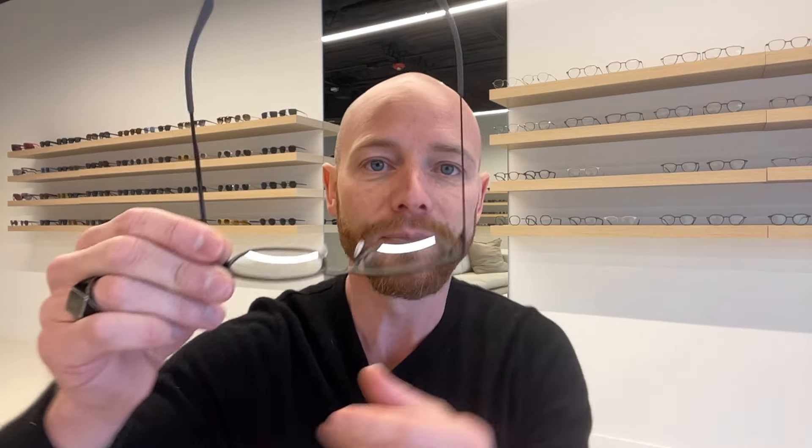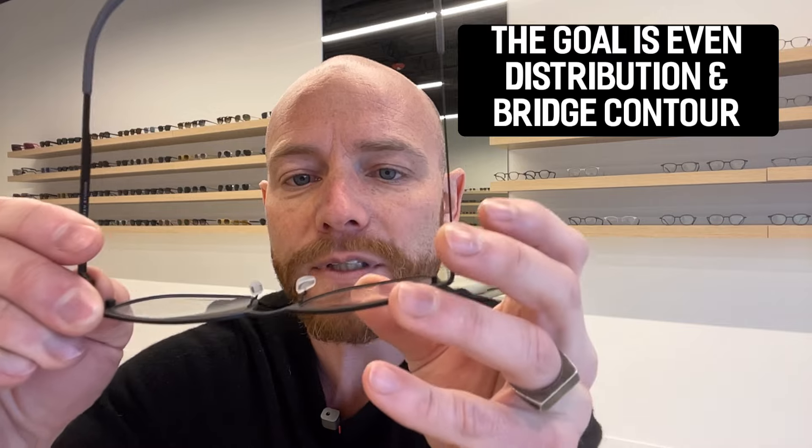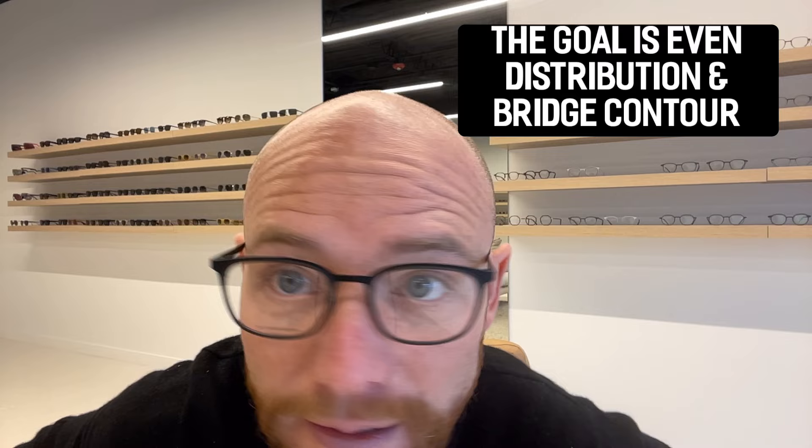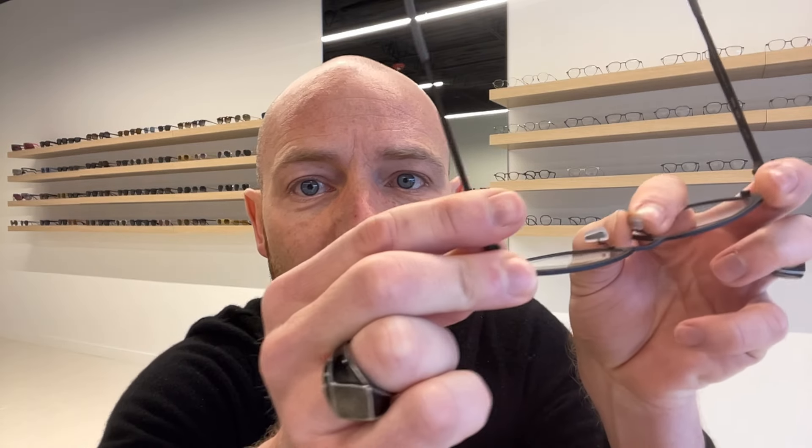A common concern for people who get red marks on the bridge of their nose is that the nose pad isn't sitting evenly. You're not getting full contact — it's digging in on one side, with the bottom touching before the top. I'm going to move the bottom of the pad away from the middle, letting the top go in naturally, to see if it contours to my bridge better. The goal is even distribution on the bridge, so you don't have spots digging in.